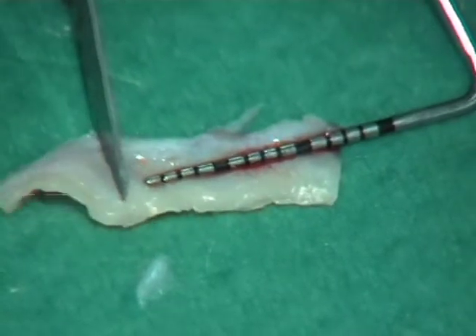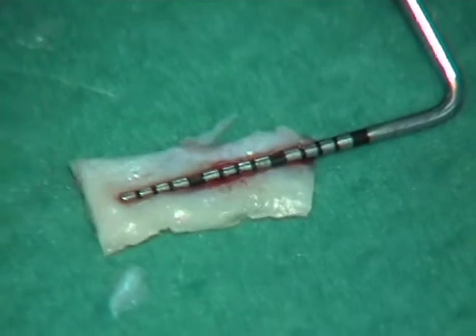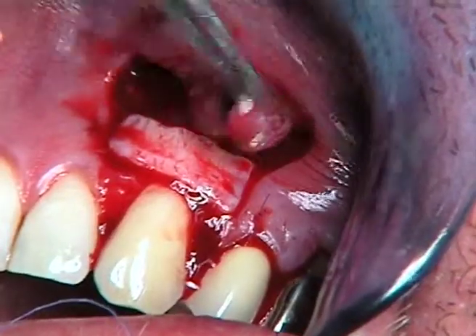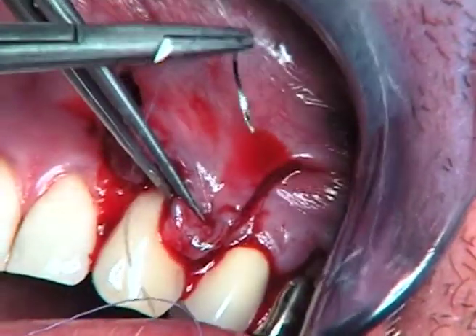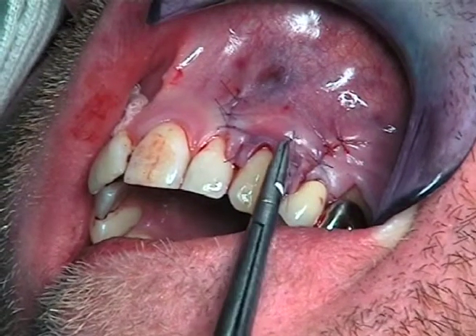It's quite rare that it's so concentrated. Here you have the graft in the good position — this is the good position — and here is the last suture from the flap.